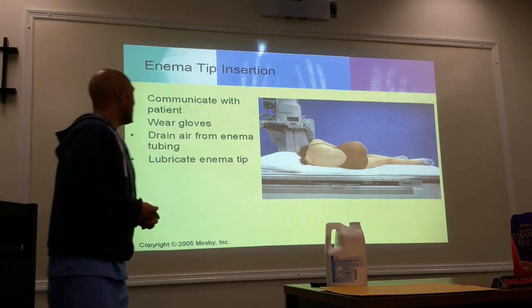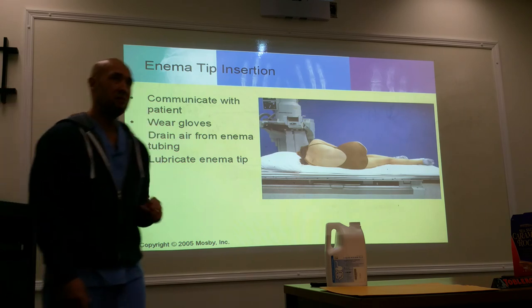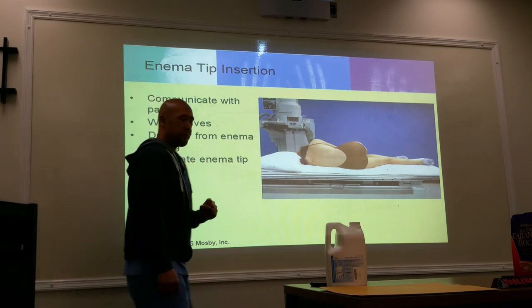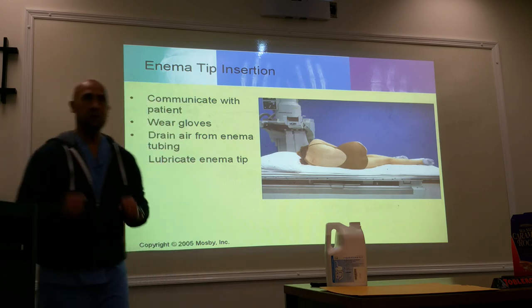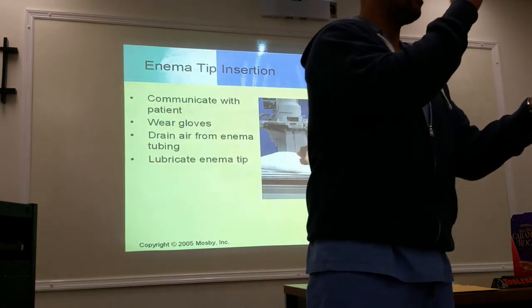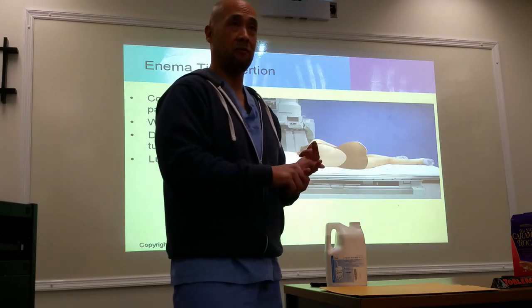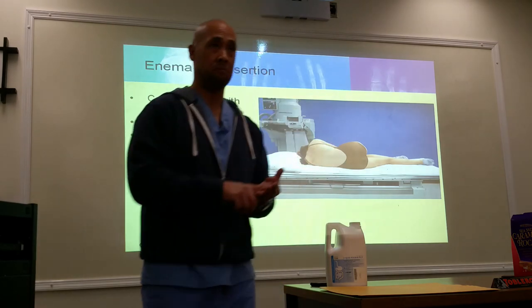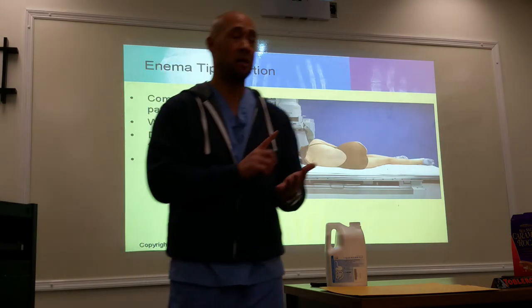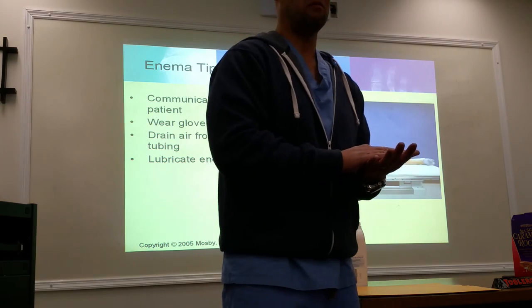All right. So, anyways, enema tip insertion. Communicate with the patient. Wear gloves. Let them know what you're going to do. So here's the routine. Patient comes in. I'm going to do the history. What kind of problems have you had? Have you had this procedure done before? Any chance of you being pregnant? Any chance of you having surgery? Have you had any surgery? Do you have any upcoming surgery?